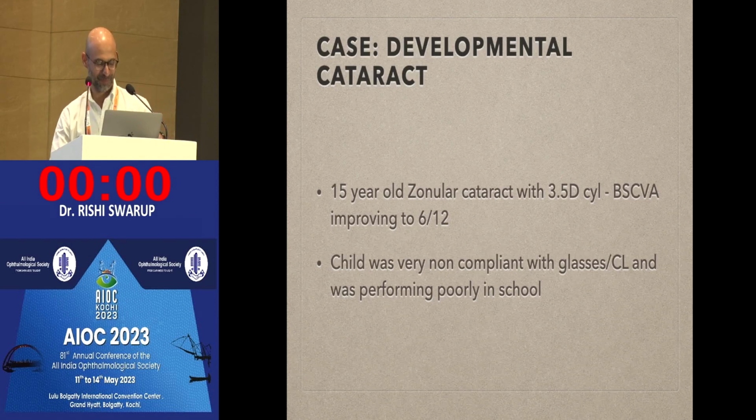I think what you showed was that the contraindications for toric IOLs are almost none now. Yes, it's coming from a corneal surgeon's perspective. He showed it in ectasias, post KPs, and other things. Now let me switch the table and say, from a cataract surgeon or a comprehensive ophthalmology perspective, do you have any contraindications for toric lenses, like say pseudoexfoliation, loose zonules?